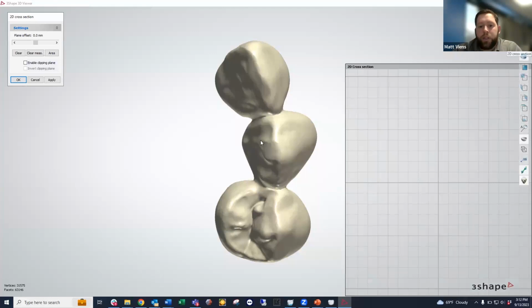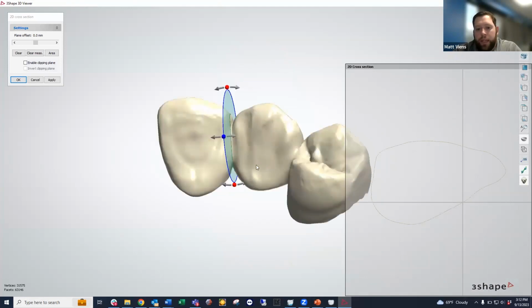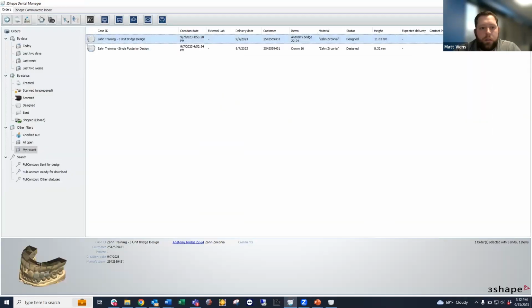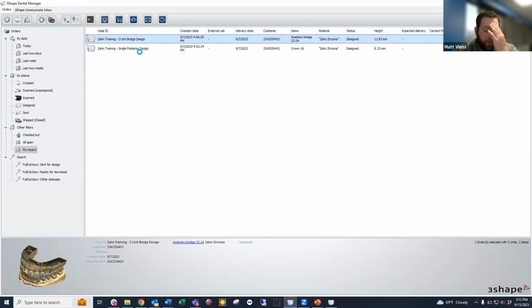This allows us to draw a line from whatever view we're currently looking at and dissect that model and show exactly what that model looks like in a 2D cross section. Now, a thing that I don't have in this stage that I do have in the design stage is an option to check the area. So I should go back to the design real quick. We're going to go into redesign here.